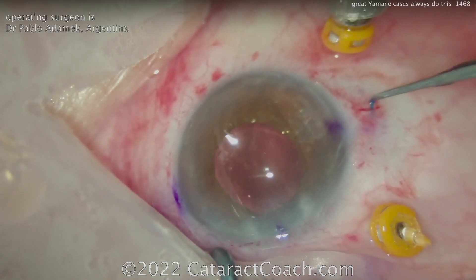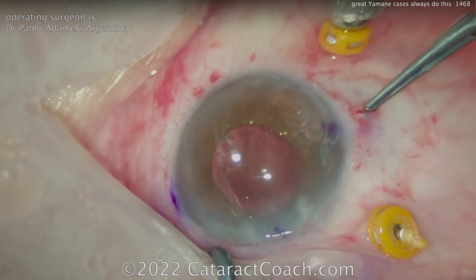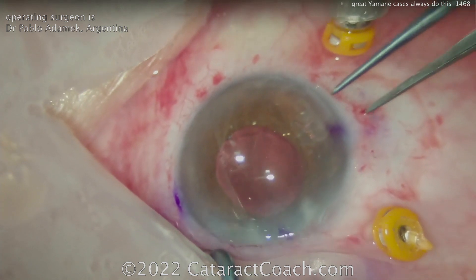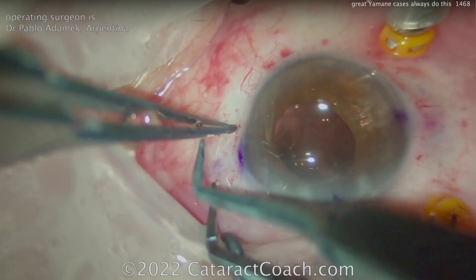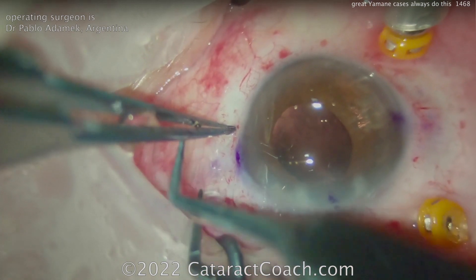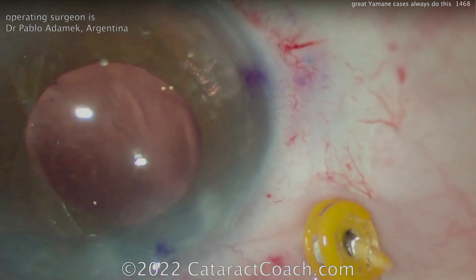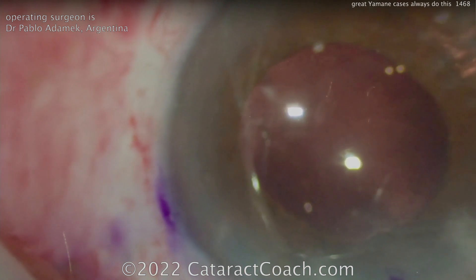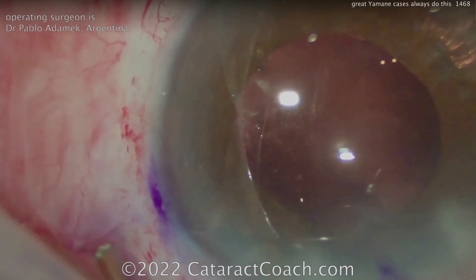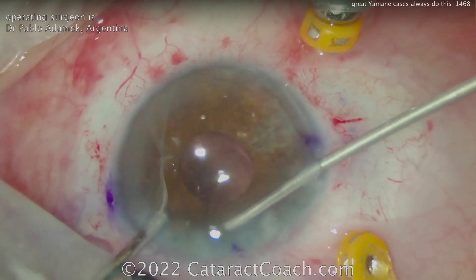Both flanges have been created — tuck them in. Make sure you push that flange deep into that little pocket or tunnel. You don't want the flange to just sit under the conjunctiva. I like this technique of using one arm of the tying forceps to really push it in there and wedge it in — that's a nice technique. That looks beautiful. This patient is going to have a fantastic outcome. Beautiful surgery for both these doctors who are vitreoretinal surgeons featuring their videos on CataractCoach.com.